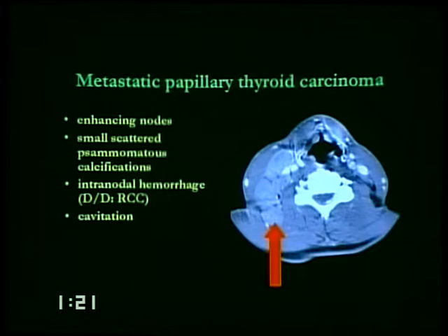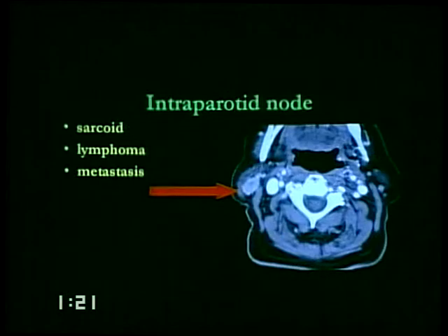However, you can have certain typical patterns which are classically associated with other disorders. For example, metastatic papillary carcinoma from the thyroid gland is very, very hypervascular, so you see bright lymph nodes, highly cellular, or enhancing lymph nodes. But lymph nodes that hemorrhage within them can present identically, so it's a very non-specific finding.